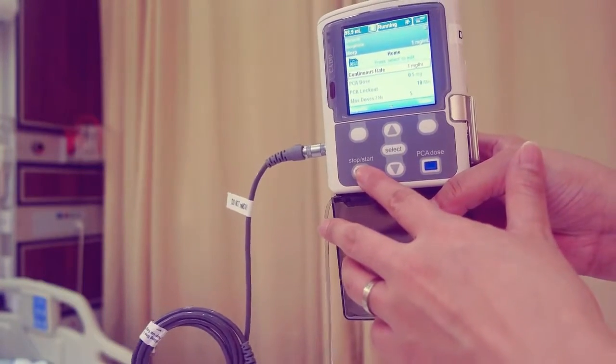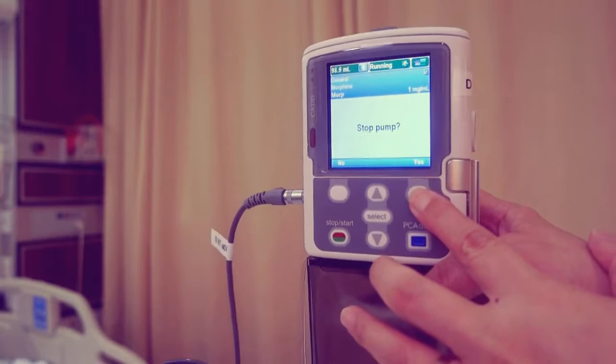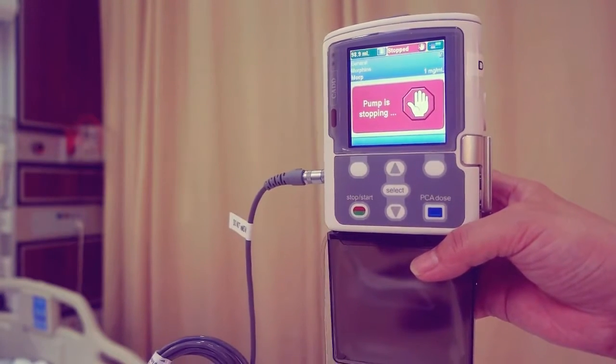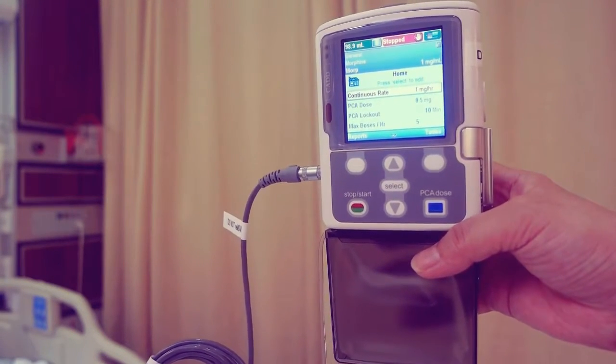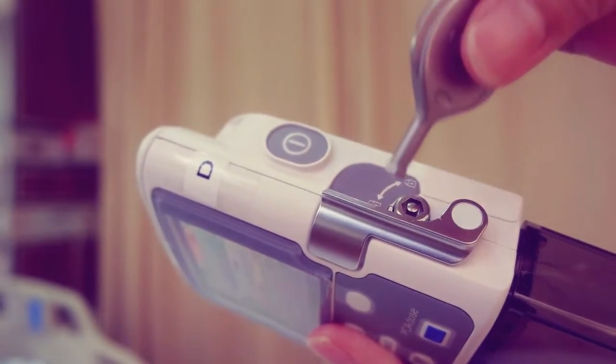Press the stop start key and the stop pump displays. Press yes. Remove the empty cassette and attach a new cassette.